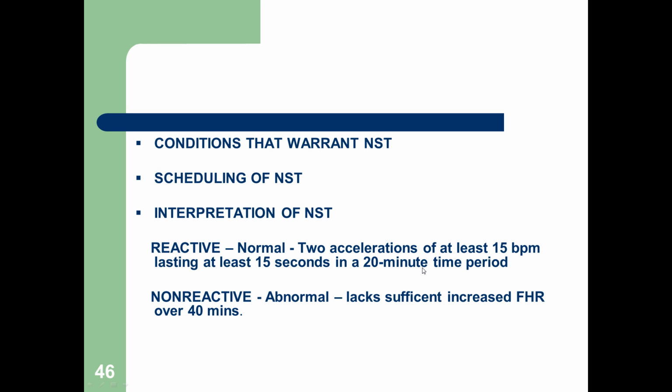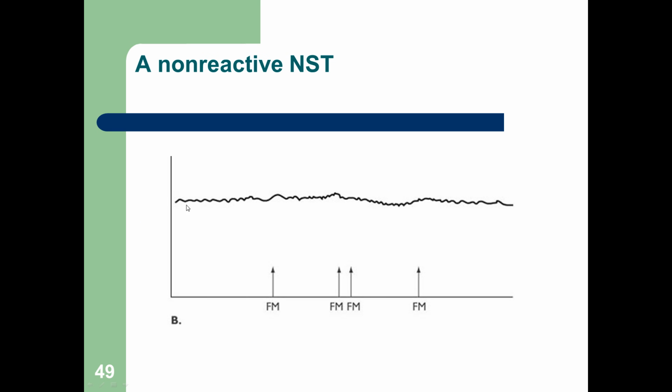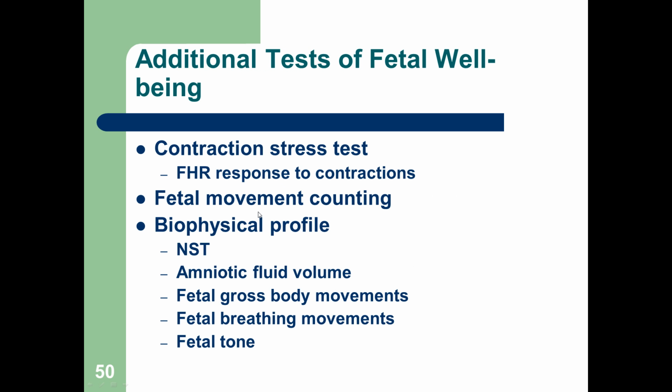So reactive, we want to see two good accelerations. Here's two. We got three good accelerations. See, here's your baseline, so that's gone up. Okay, so that's good. Here's a non-reactive. We don't see very much acceleration, okay? And certainly it's not accelerated for at least 15 seconds. So this is non-reactive, okay? We want to see reactive. Reactive is good. That means the baby's doing well, heart rate's accelerating in a normal manner, and that's what we expect.